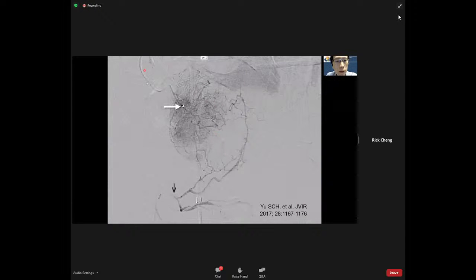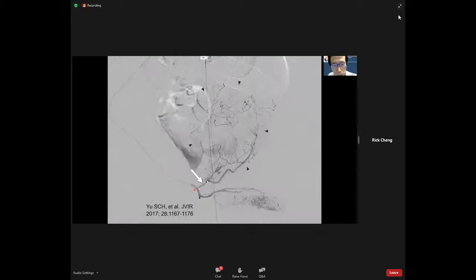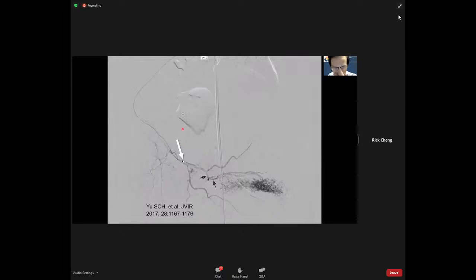Say in this case, the microcatheter tip is over here, the prostate is over here, and the anastomosis. This is the internal pudendal artery, this is the dorsal artery of the penis, and the cavernosus artery. So in this case, we take away the microcatheter and put it into the internal pudendal artery like this. Then we do the embolization from this side first to embolize all this anastomotic branch through the internal pudendal artery before we go back to the prostate artery.